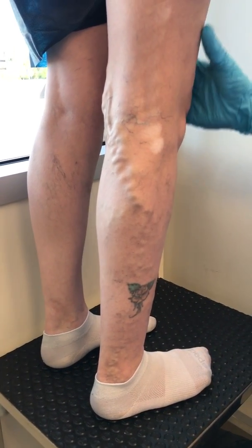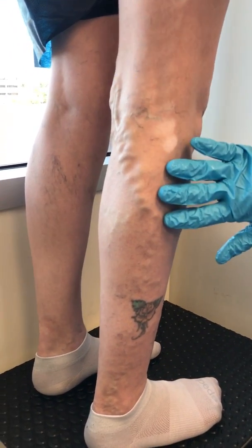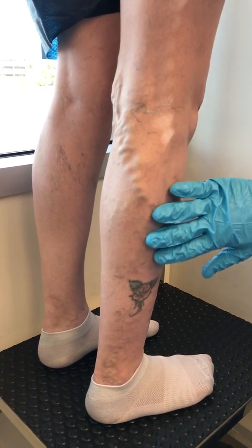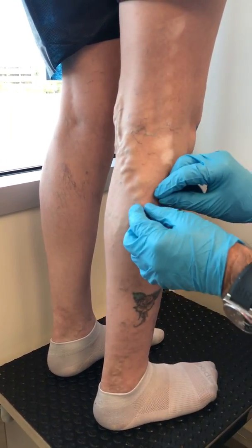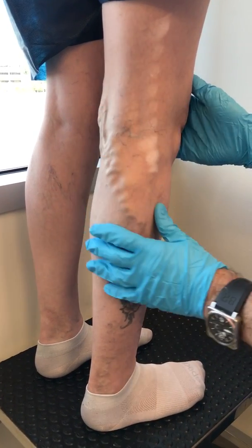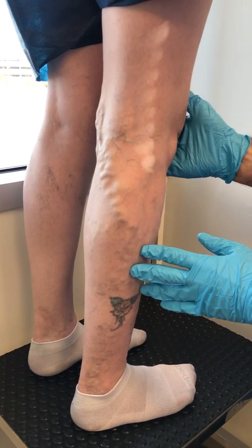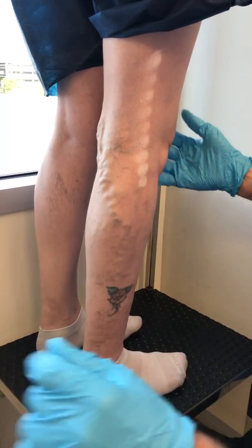Today all we're going to do is close that pipe, and then when she comes back next week, this is all going to be flattened down. We're going to determine what we do with this — whether we just inject this with what we call sclerotherapy, or if we pull this out with some little tiny hooks. We won't do that when she comes back; we want to see, because sometimes doing this is going to have an impact on that. So we'll show you a before and after next week, and she's been really sweet to let us do this all.